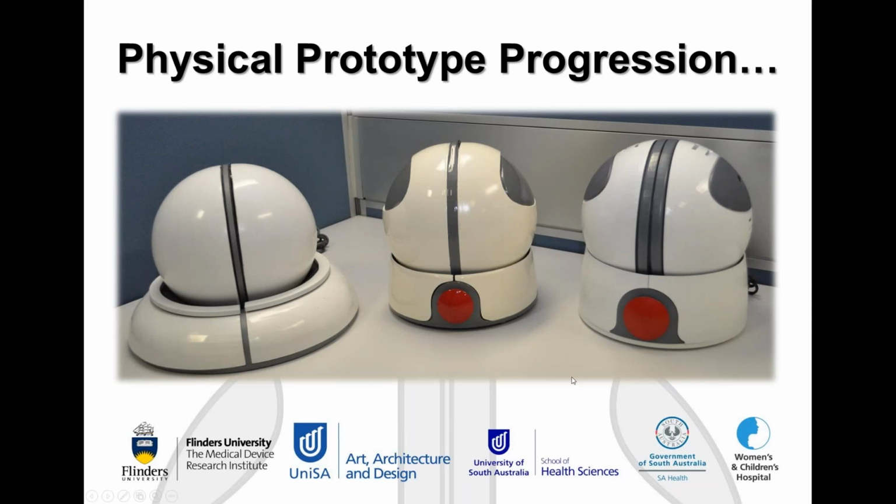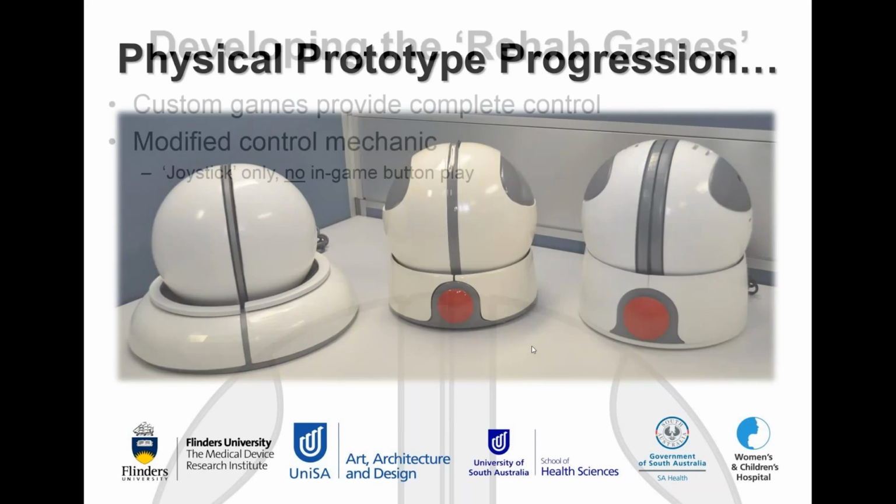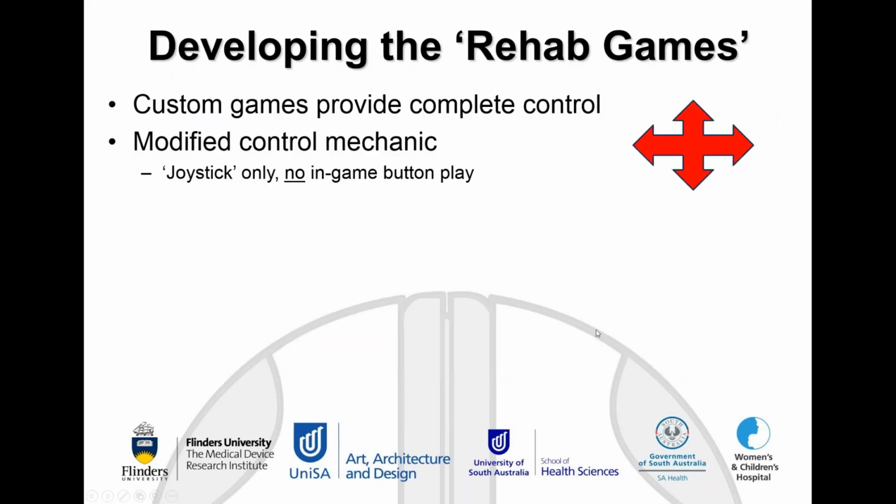And you can see they have a very similar form, but from a technical perspective, under the hood, so to speak, there's differences in each of them to do what we would like them to do and for the children to use them in the way we'd like them to use them. All of them still function and work, so if I was to plug all of them into our gaming system, they'd still work. So that was how we designed, and that was the methodology we took into developing our controller.